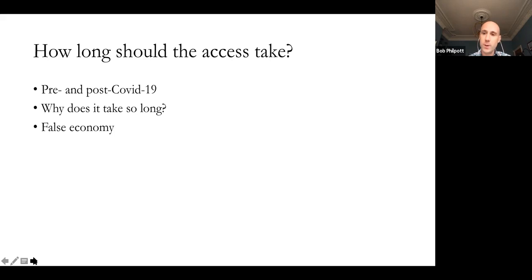I often say to our students, in terms of doing an endo access or a root canal treatment, I would like to see them mark out on a piece of paper: 9:15 local administered, 9:30 rubber dam on, 10 o'clock canals located. I think we're going to need to adhere to that, because sometimes it takes so long because we just get engulfed in the whole process. We become almost psychologically aware that it's a very difficult thing.